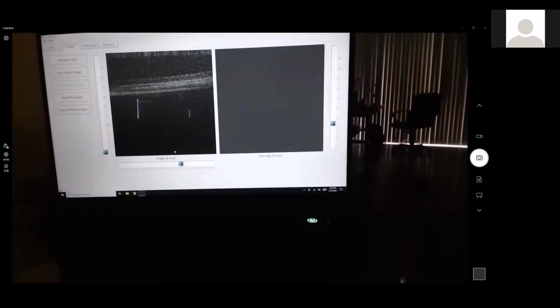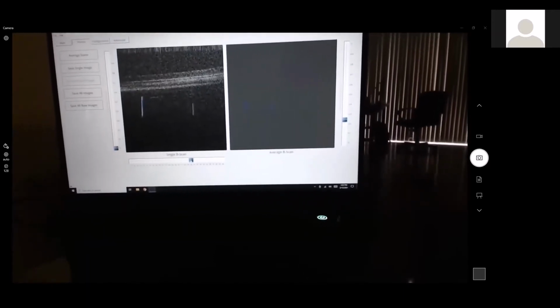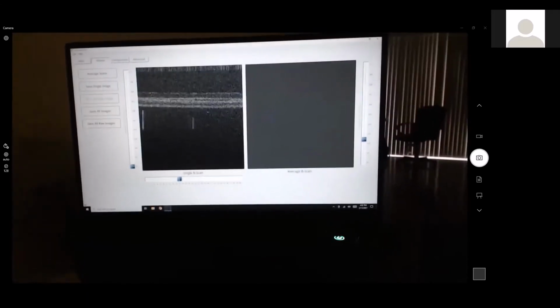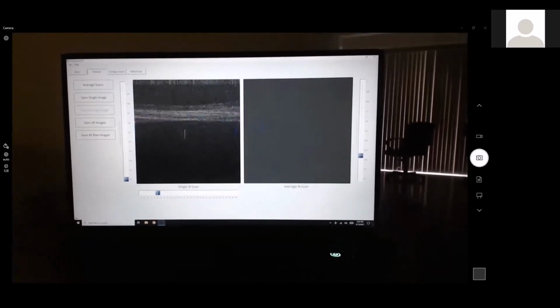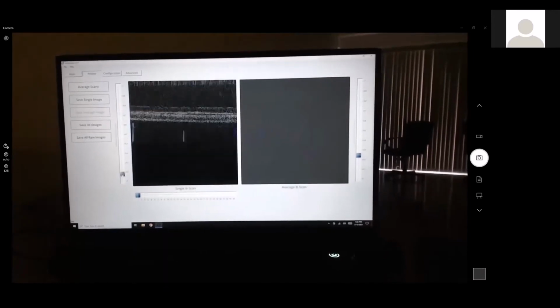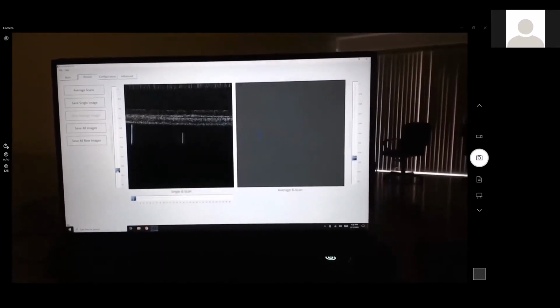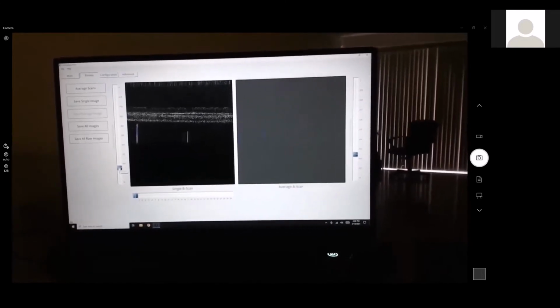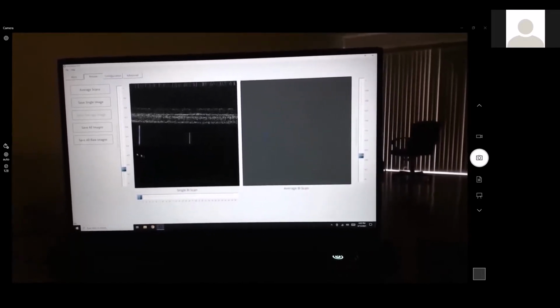So as we can see, we did the cross scan on the retina as well. When we review the images we've captured here, we're getting that same kind of teeter-totter effect. That's, of course, it jumping back and forth from horizontal to vertical scans. Let's keep the noise down a little bit.